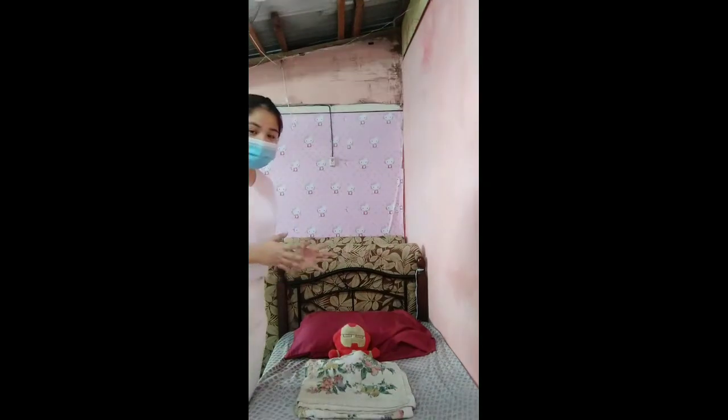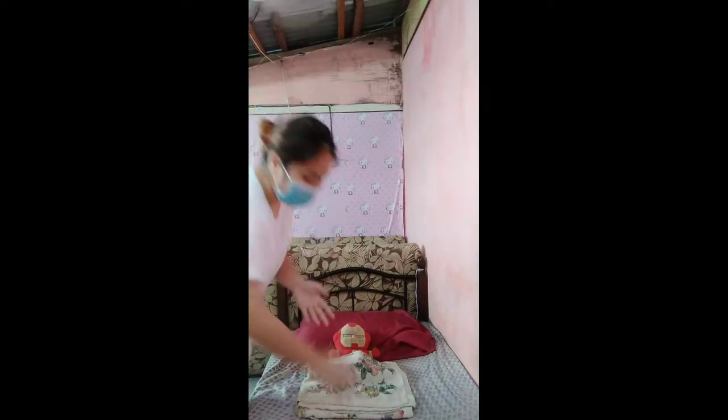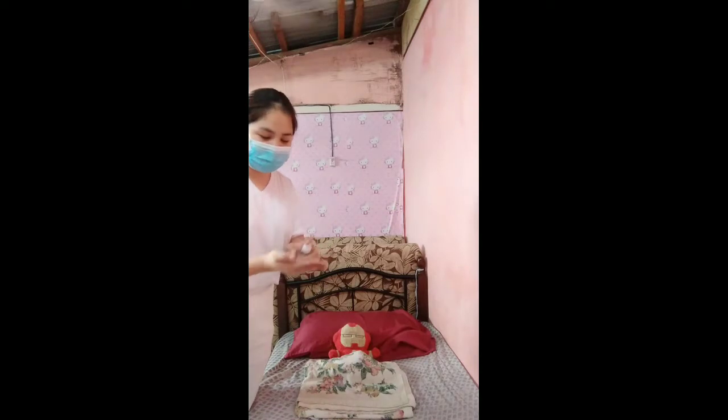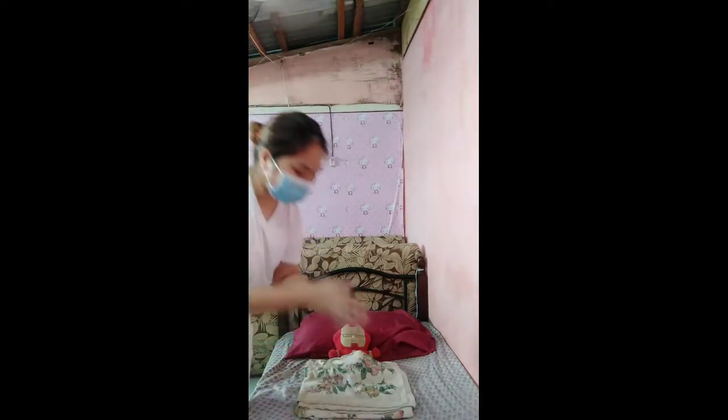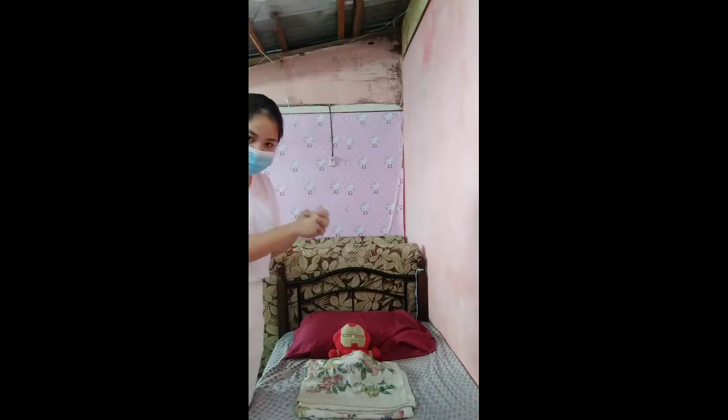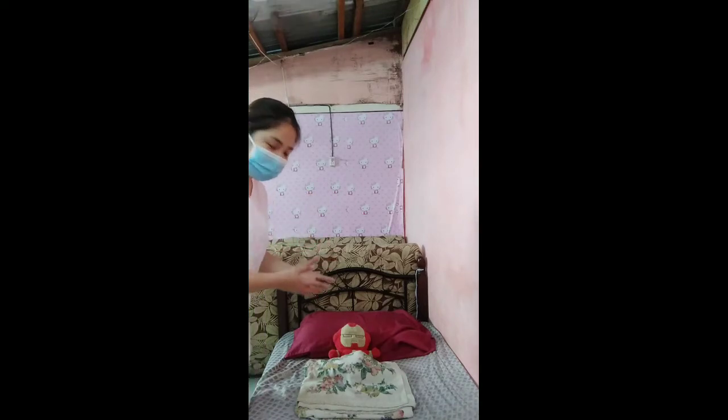Perfect. After identifying any allergies and the name of the patient, we need to perform hand hygiene first. So I have here alcohol. After performing hand hygiene or putting alcohol on our hands, we need to put the patient in a comfortable position, flexing the knees upward, ready to perform the catheterization.